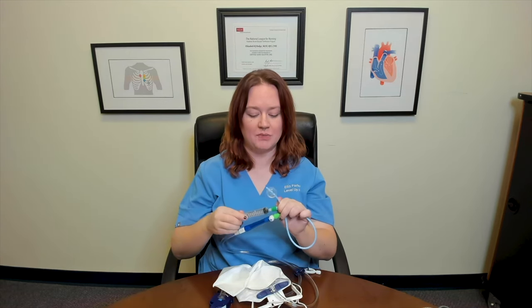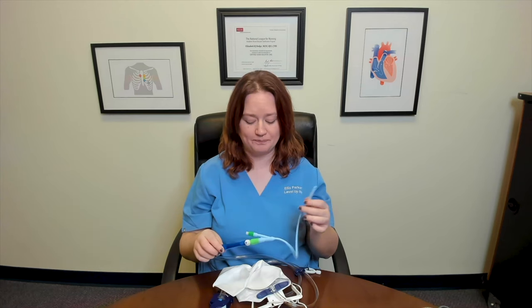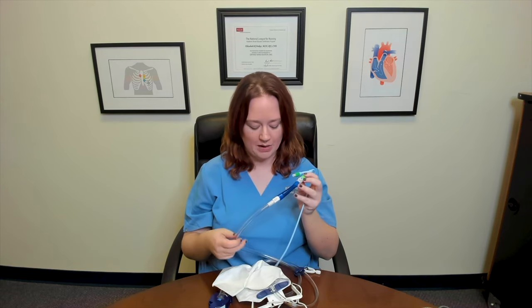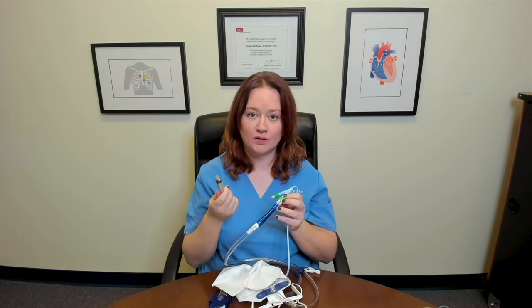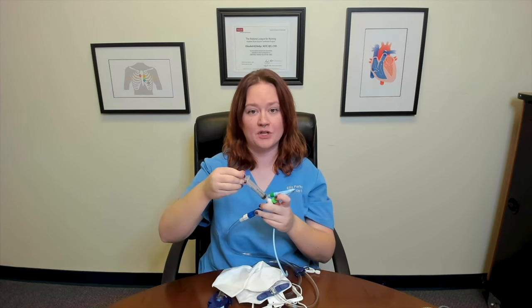This also hopefully encourages you to make sure that you withdraw everything that was put into the balloon before you withdraw it from your patient, so that you don't do any damage to your patient's urethra. Most catheters now come with a luer lock port. Occasionally you'll still find ones with a rubber stopper where you'd need a needle to get a sample, but most are luer lock. To obtain a urinary sample, I would likely clamp my tubing so urine can't proceed into the bag, then get a 10 milliliter luer lock syringe, clean my port site, attach my syringe, and from there withdraw my urine sample. I would not get urine from the bag if this is a pre-existing indwelling urinary catheter.